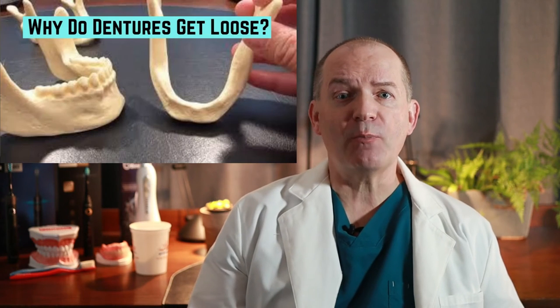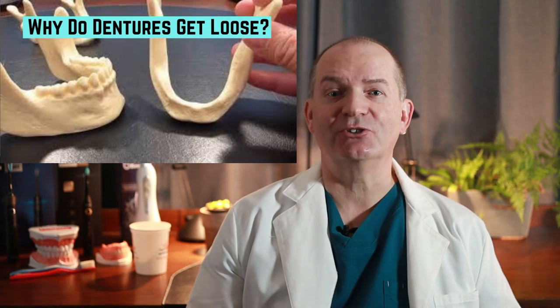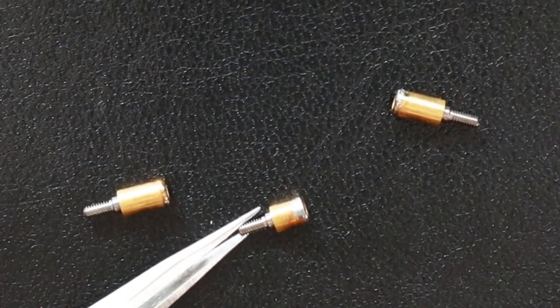The second most common issue is your overdenture needs a reline. Just like with a regular denture, the parts of the jawbone without implants will continue to shrink over time. Check out my Why Do Dentures Get Looser Over Time video to learn why that happens. When the jawbone shrinks, the overdenture won't rest on your gums anymore. Instead, it'll end up being supported by the implant posts. This is a problem because a snap-in denture is designed to be supported by the gums. The implants are only used to hold the overdenture in, so when this happens, you will start wearing through the plastic snaps very quickly. Then you'll also start to wear down the implant posts as well.